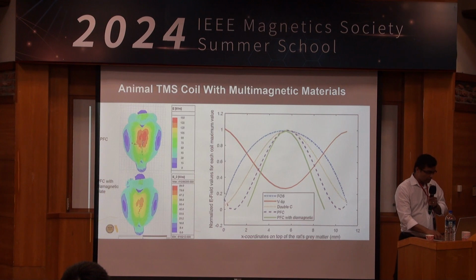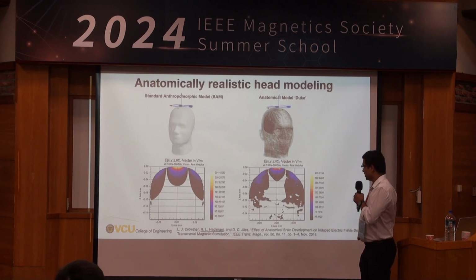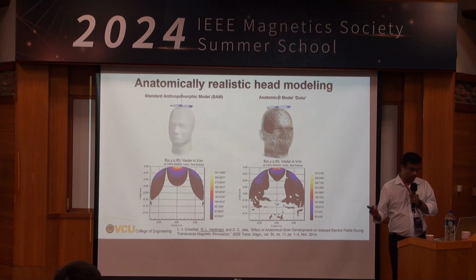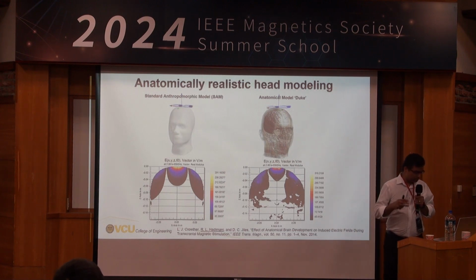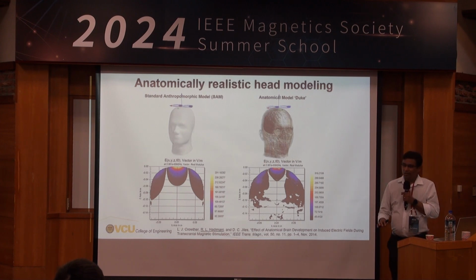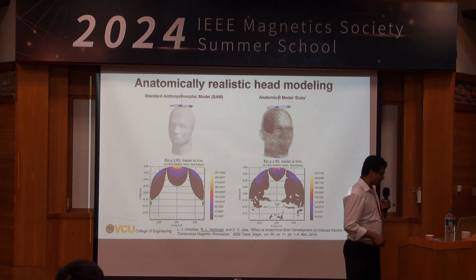We published just the design, and now we are fabricating it for animal studies. We have animal studies ongoing. We used another core to look at other effects. I can talk about that later, so stop by. So these are all different coil designs that are in the works.